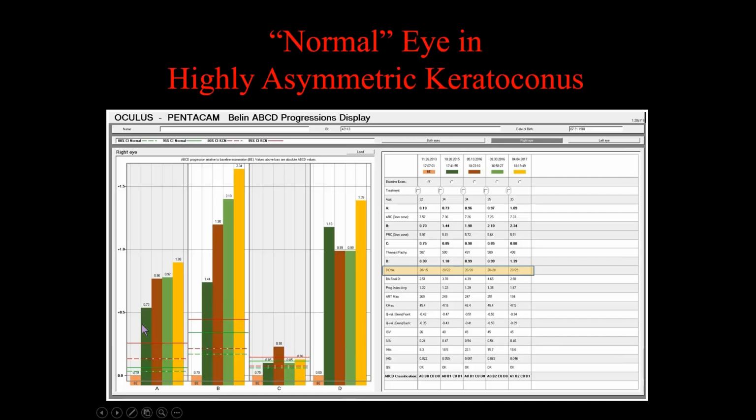Had this been available, both the patient and the surgeon could have said, okay, I want to show you this. Notice, because they know they have keratoconus in the other eye that required treatment, you have keratoconus in this eye, and I can show you you're undergoing significant change. We should be intervening now before you have permanent loss of vision. This was not available. They waited until the patient actually came in and said, okay, now I've lost some vision. I can tell a difference. Let's get treated. Really, they should have been treated over here to preserve the vision.